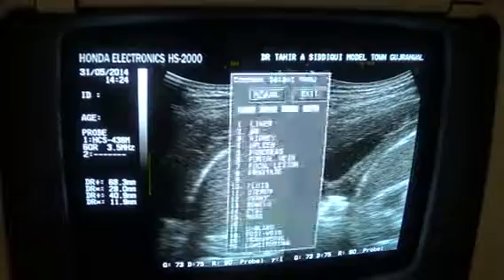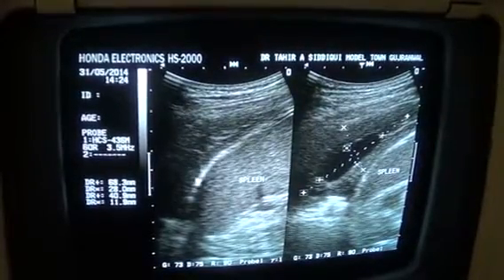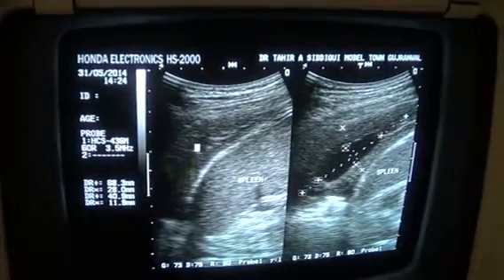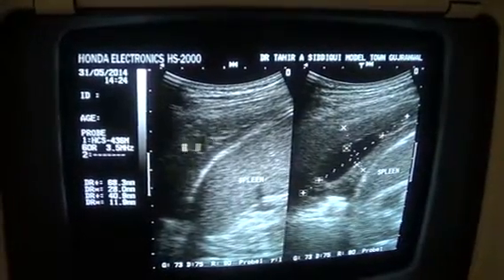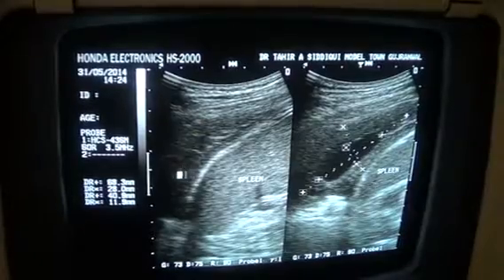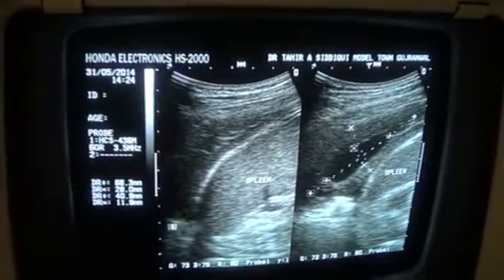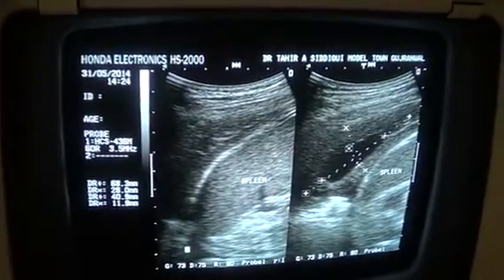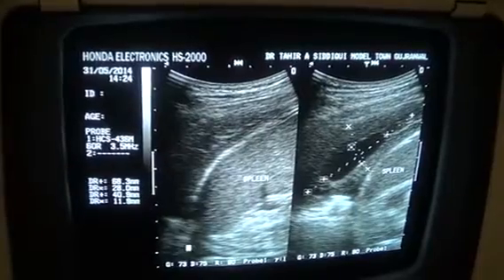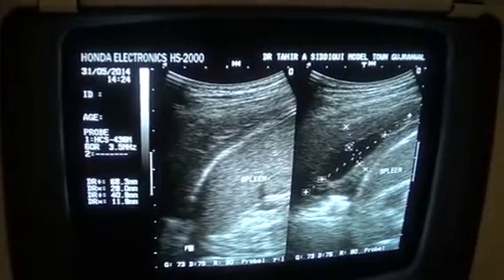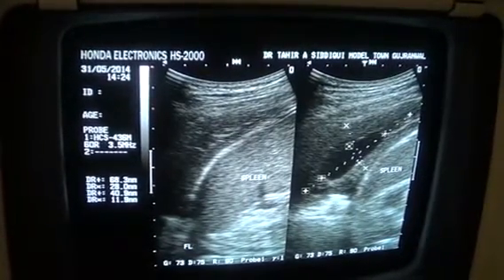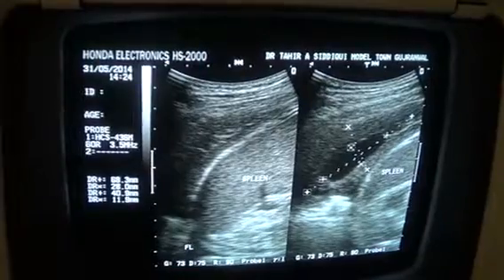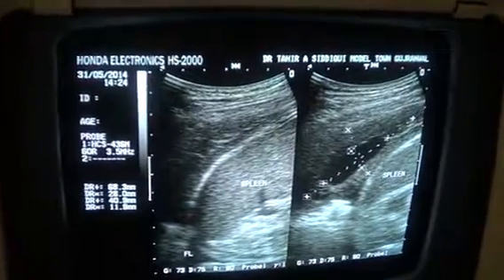This is the spleen. This is the left hemidiaphragm and this is the left pleural space where you can see the air and the fluid. So thank you very much — this is the case of the day.